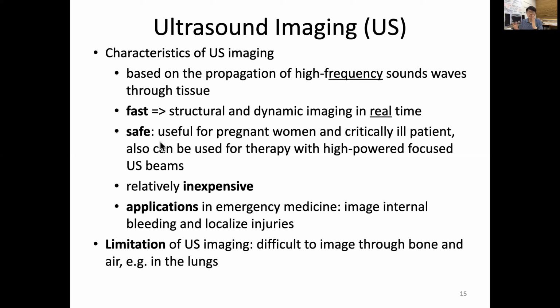So in principle, it's relatively inexpensive. And because of this, there are many applications, and ultrasound is one of the most widely adopted medical imaging technologies inside the clinic. For example, in emergency medicine, for imaging internal bleeding and localized injuries inside the body, we probably use ultrasound.